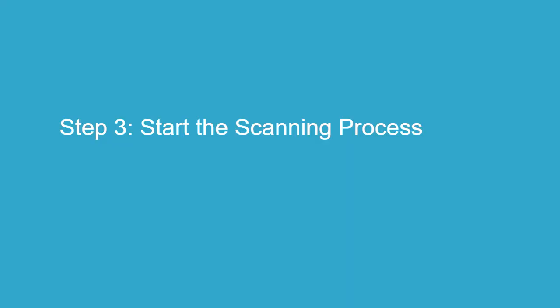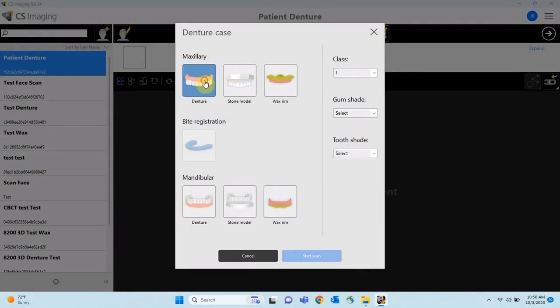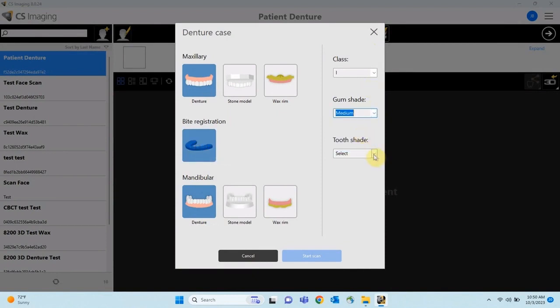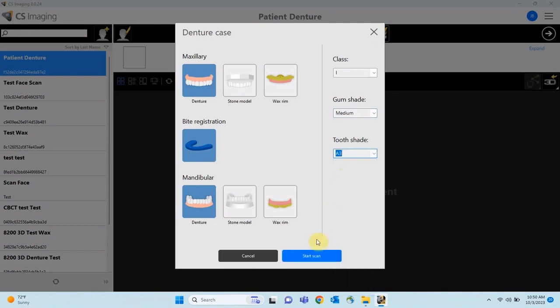Step 3: Start the Scanning Process. The next step is to input the necessary details for scanning the dentures. Complete the Rx form with details such as object type, class of occlusion, and shades. Select the appropriate settings for wax rims or denture over denture scans, then click Start Scan.